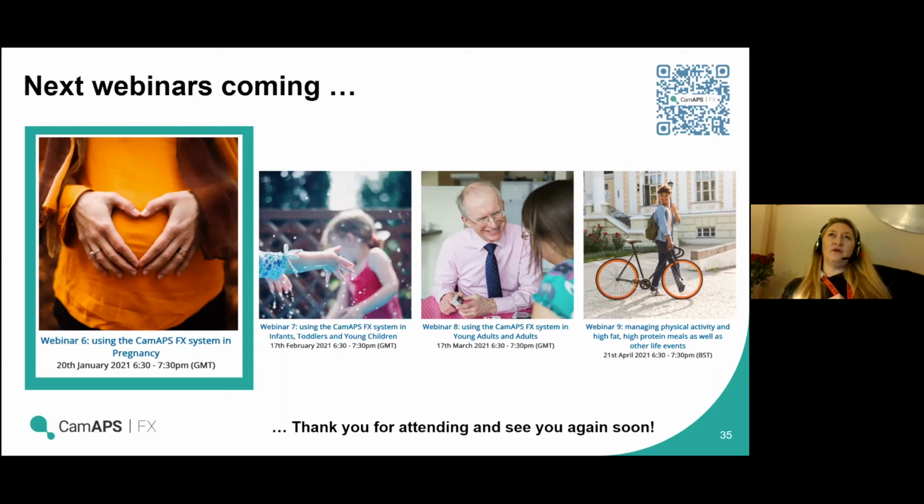We've talked in some of the other webinars about the use of the arrows for treating hypos, but having a strategy that you stick to is useful. If you've got an arrow on the slant and you're heading for your low level, think about whether you need 4 grams of carbs, a fruit pastel, a jelly baby, a mint or something, just to help it skim. Or if it's all backed off for ages, but you've got a straight down arrow, you might think actually I definitely need to get in with maybe 4 or 8 grams of carbs. So it's as Charlotte says, very dependent on what's just happened in the couple of hours before and what active insulin is around.